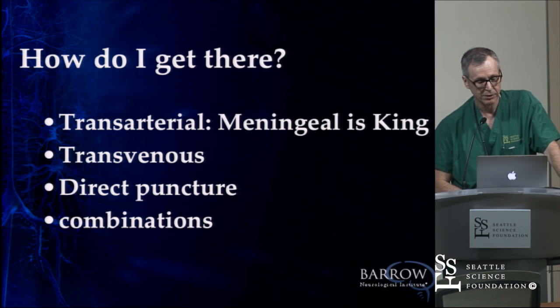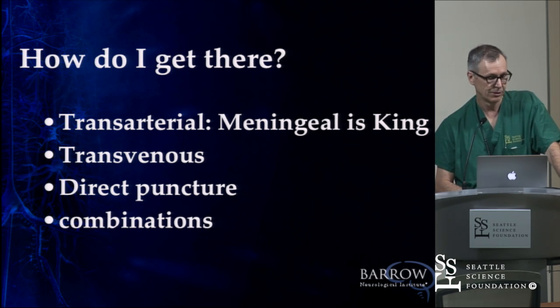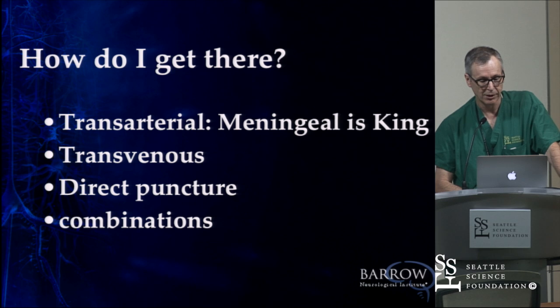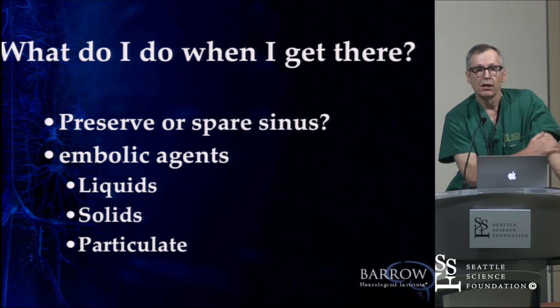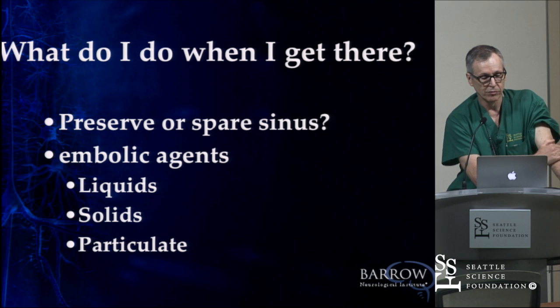That's often straightforward. We used to do a fair number of direct punctures, a little burr hole over the transverse sinus in the operating room. I haven't done a direct puncture except for a carotid cavernous fistula for a very long time. And often we used to combine therapies. When you do get there, do you need to close a sinus or can you preserve it?